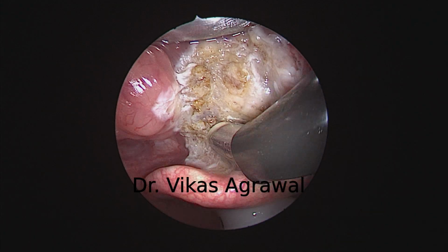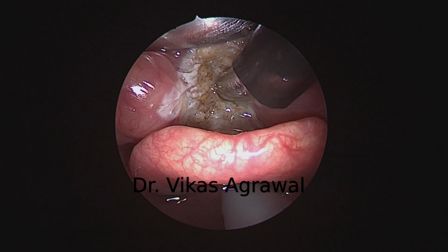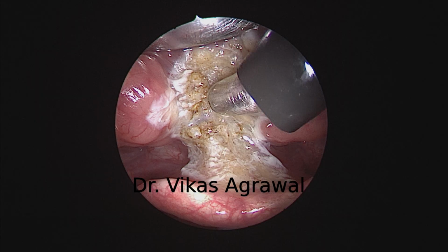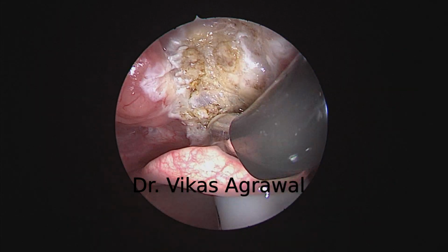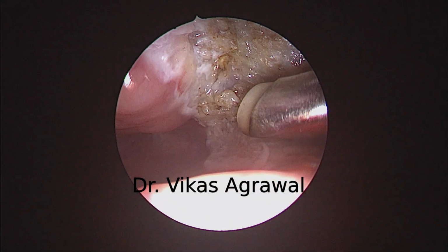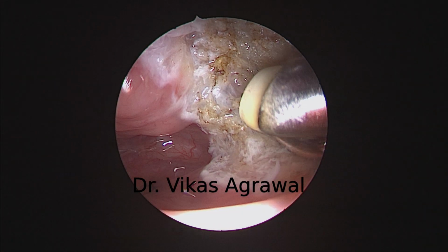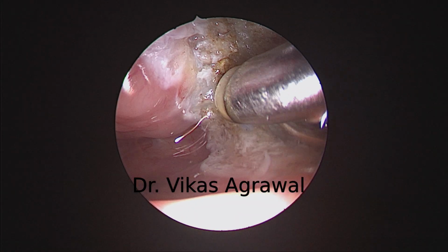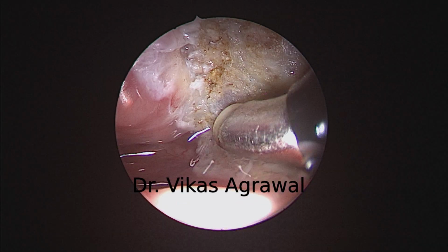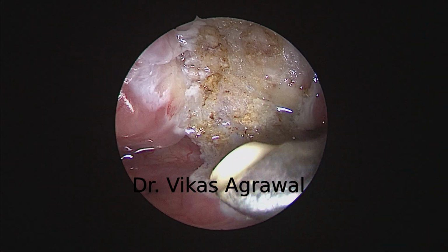Now see, I want the epiglottis to remain like this. Therefore, I'm giving a little more energy over here at the setting of 4 for coagulation. If there is any amount of lymphoid tissue here, it will still not fibrose. So I just want to remove this lymphoid tissue completely. Can you see this? Now there is no lymphoid tissue, and this will fibrose to the fullest extent.